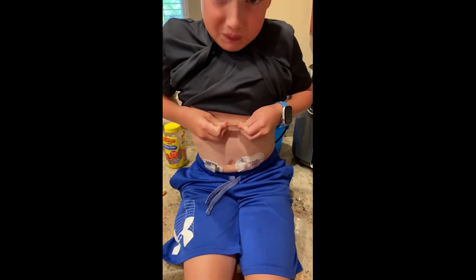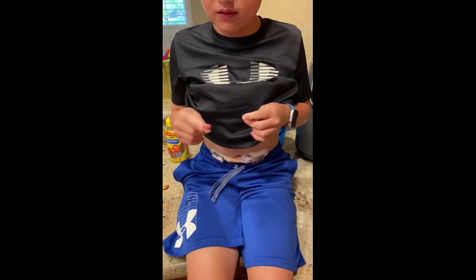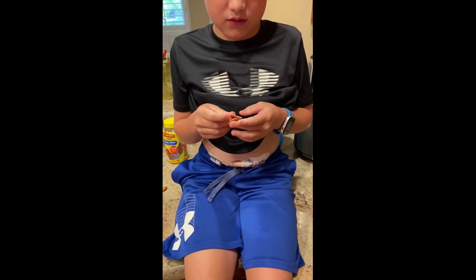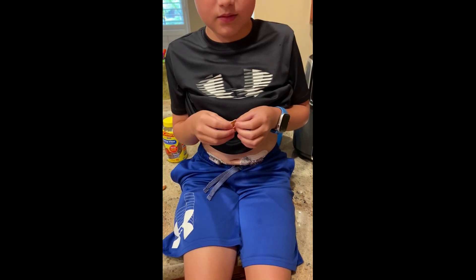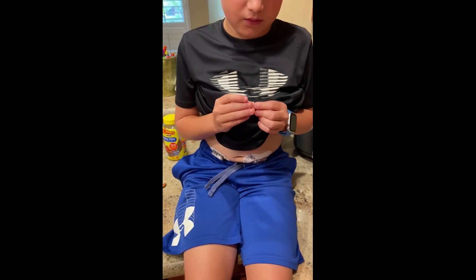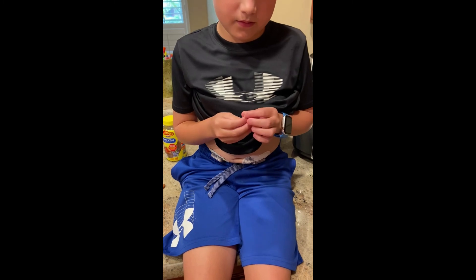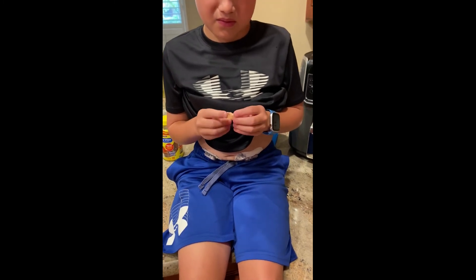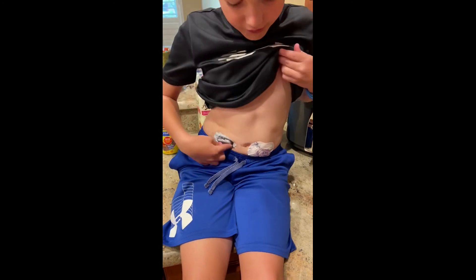We're going to go ahead and swap the transmitter now. So what I have to do is first go into Abel's Dexcom app and stop the sensor. The sensor has stopped.